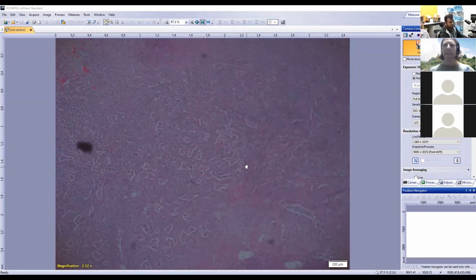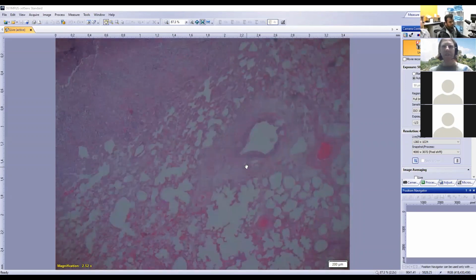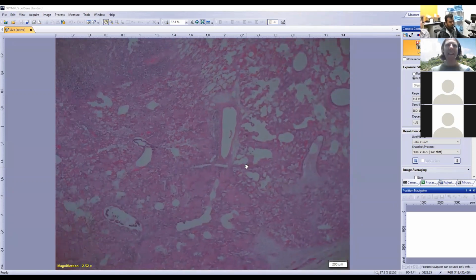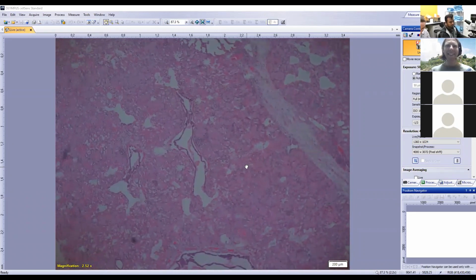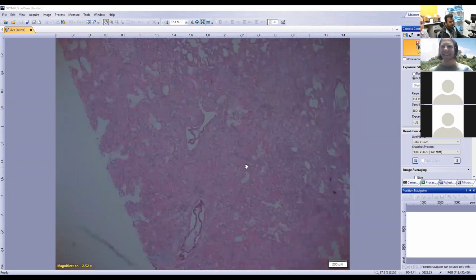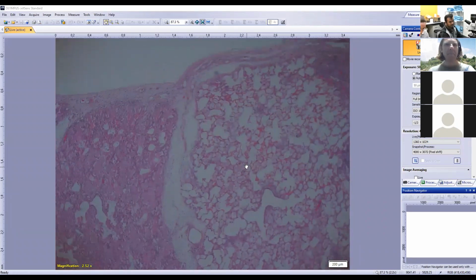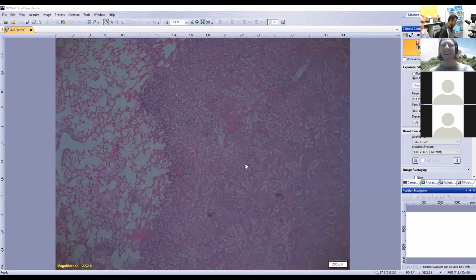And Katie and Viviana, Strep zooepidemicus, E. coli, enterotoxemia, love those. Cool. Yeah, so that's a very different picture on that second slide. I love it. Yes, cool. Some atelectasis, emphysema also in some places. Okay, that's great. Cool. Well, we might wrap it up there for today then. Excellent descriptive slide. Thanks so much.